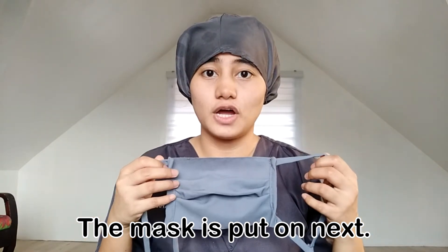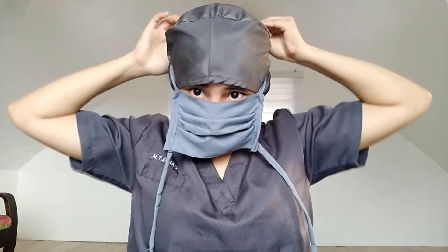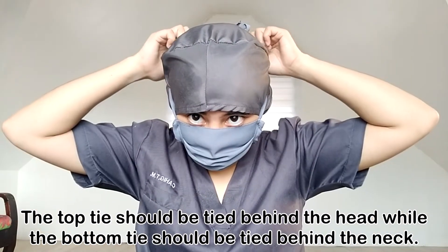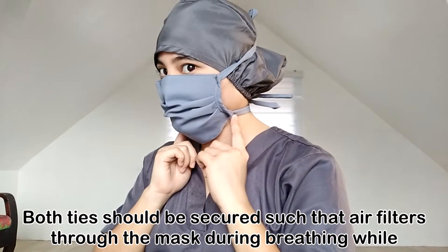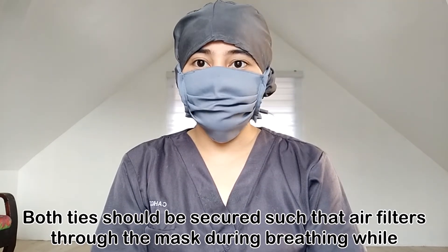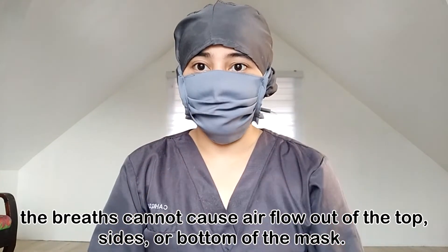The mask is put on next. The top tie should be tied behind the head while the bottom tie is tied behind the neck. Both ties should be secured such that air filters through the mask during breathing while the breaths cannot cause airflow out of the top, side, and bottom of the mask.